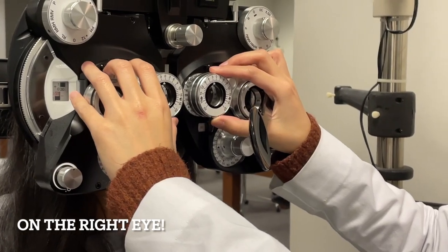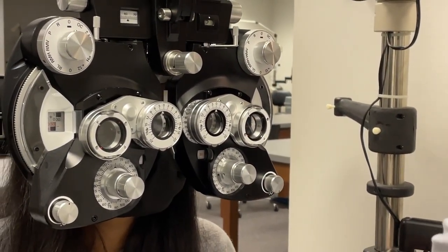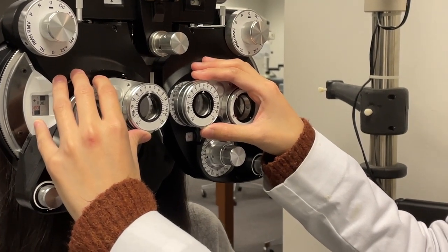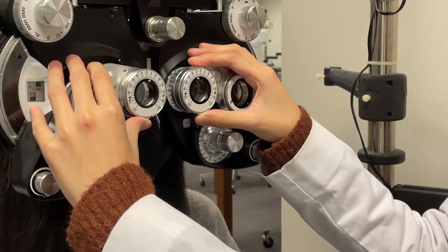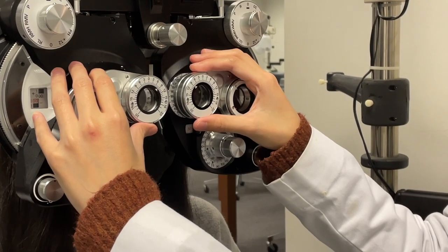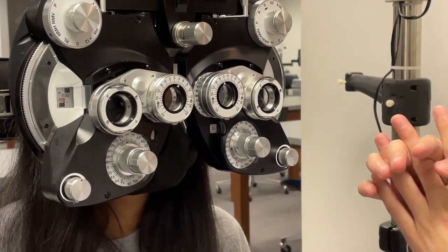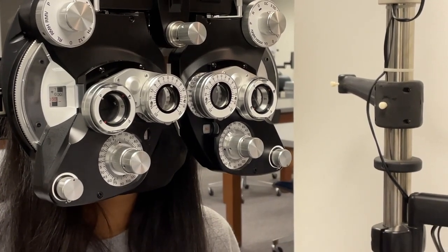All right, Mrs. Lee, I'm now going to be seeing how well your eyes work together as a team. Do you see that line right there? Yes. Okay, you let me know when it becomes blurry, break into two, and then back as one. And if you don't see it become blurry first, that's totally fine as well. Okay. Two. Okay, let me know when it comes back as one. One. Good. All right, so base in ranges are 12 and 8. Mrs. Lee, that means that you have enough ranges to compensate for your ESO.